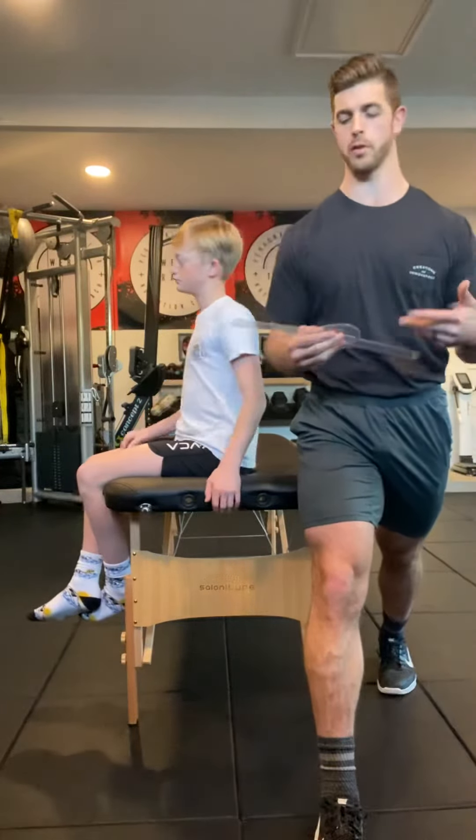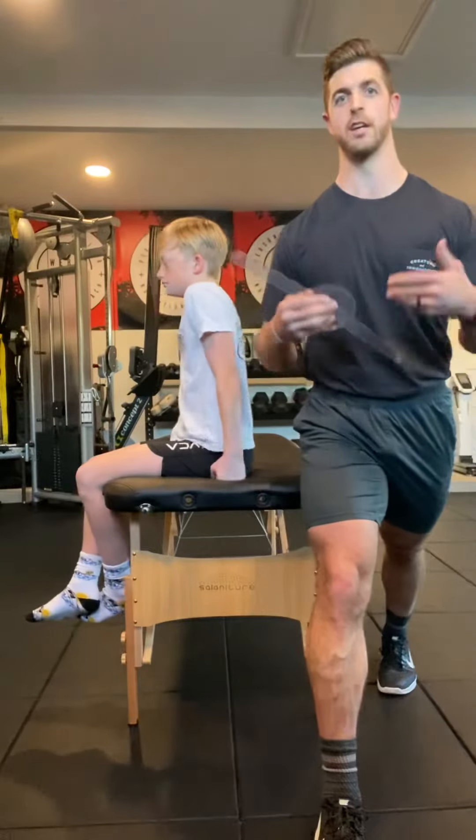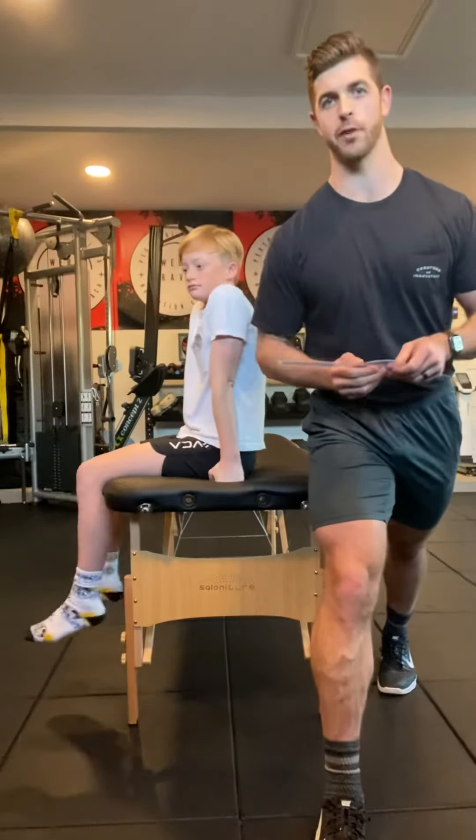He's a young athlete, he's mobile and hydrated, so 183 is actually really good. We would then make a program that works out for his design.